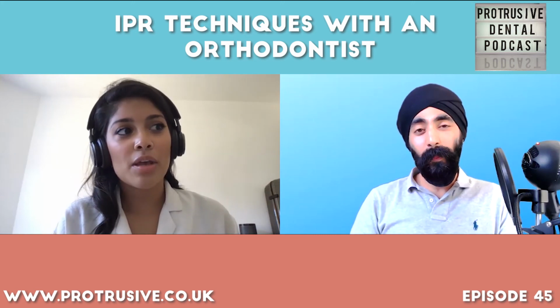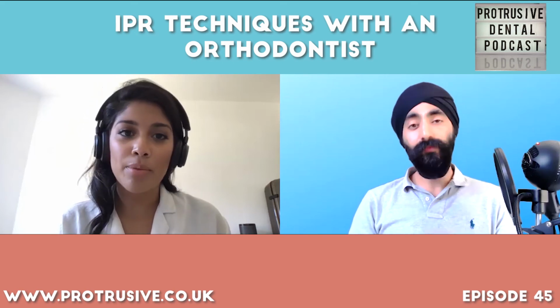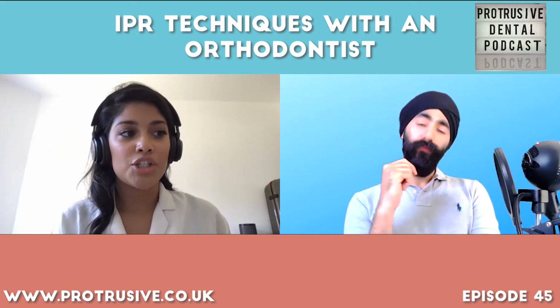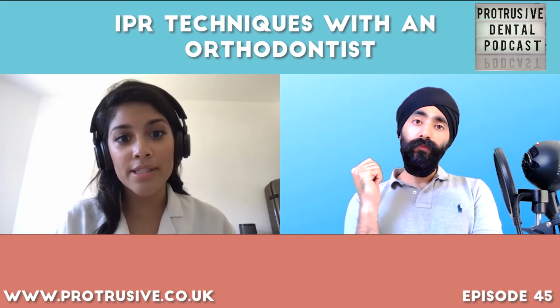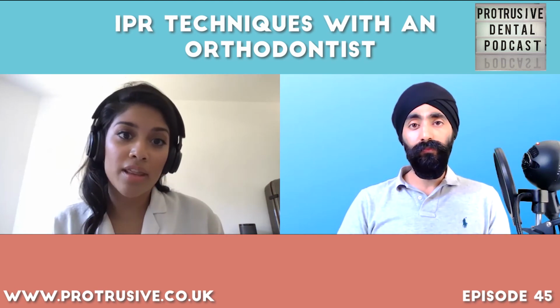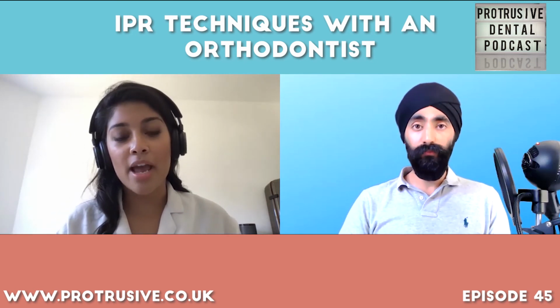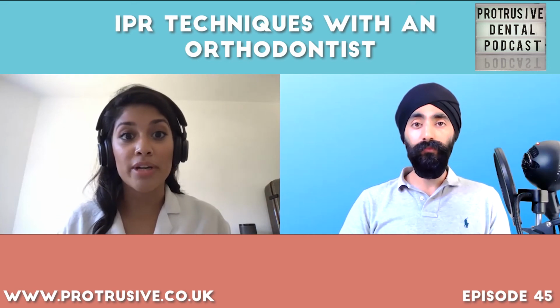I think the most important thing is planning. So it's really important to take the time at the beginning to assess how much crowding you have. Where is the crowding? Look at all your factors. What is my tooth shape like? What are the aesthetics like when the patient's smiling? How much tooth show do they display? A lot of this information you will get from your assessment.